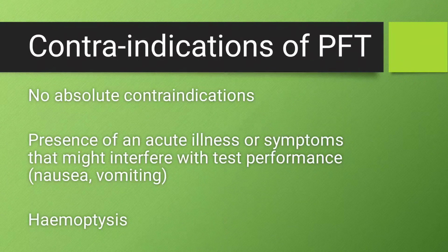Contraindications of PFT: no absolute contraindications. It is a very safe method. Although presence of an acute illness or symptoms like nausea, vomiting that might interfere with the test performance may be contraindications.